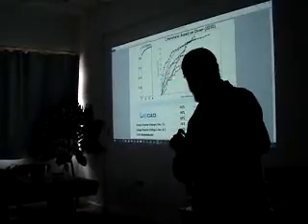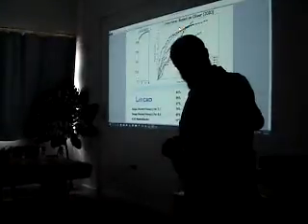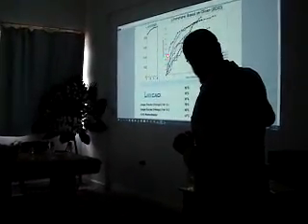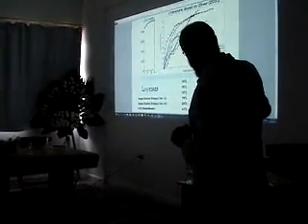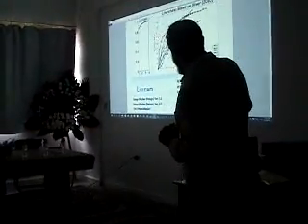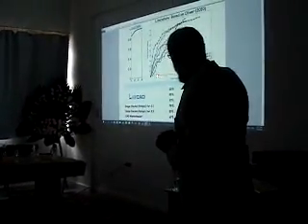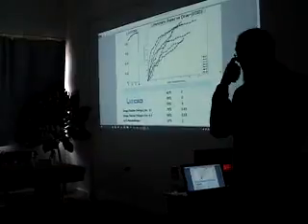Let's take a closer look at this. For example, this is the best algorithm in literature. It says its true positive detection is 95%, for example. This is 65% when it produces two false markers. This is a very important issue in detection.